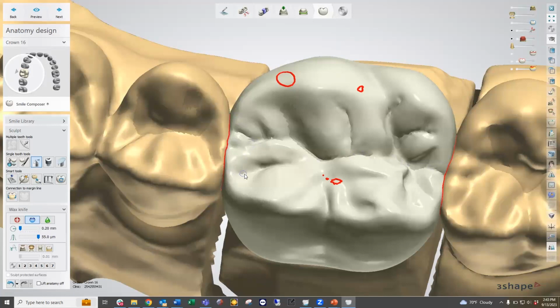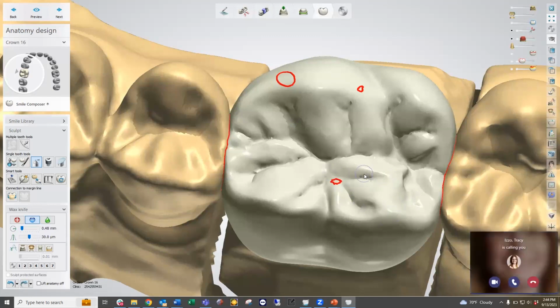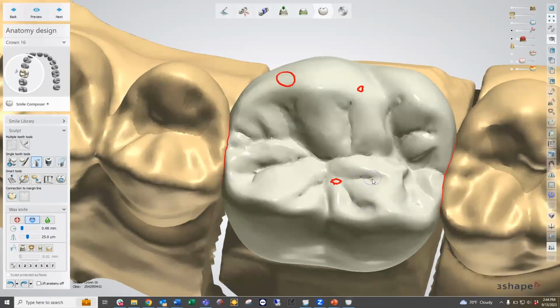All right. Once I've gone in with a nice fine tool like you see here, what I like to do is follow it up with a slightly larger tool to embolden those lines that we've already created. Because right now it looks kind of choppy and you can see a very deep groove in here. I don't like to see a very deep groove. I like it to be idealized. So I take a slightly larger tool thereafter to make it smoother or translate a little bit better. So I'm going to go one step higher and retrace. Sorry, not as intense, I should say. So I'm going to bring it down to maybe half intensity. I'm going to retrace that, and that allows us to create some nice occlusal anatomy on here.